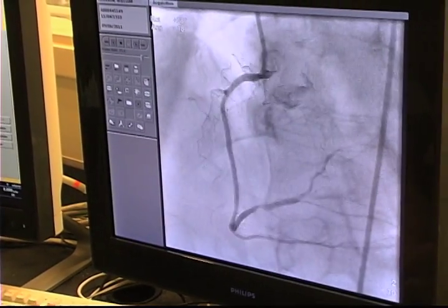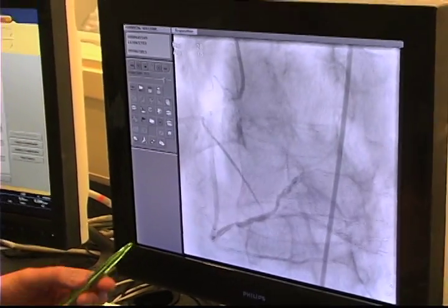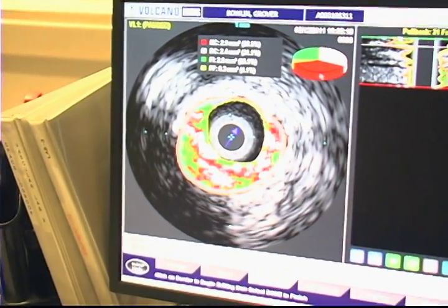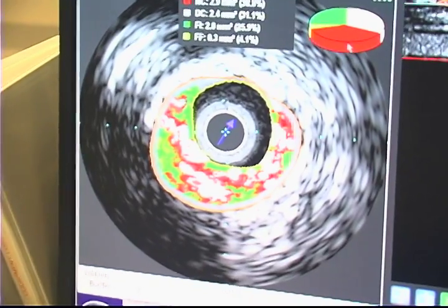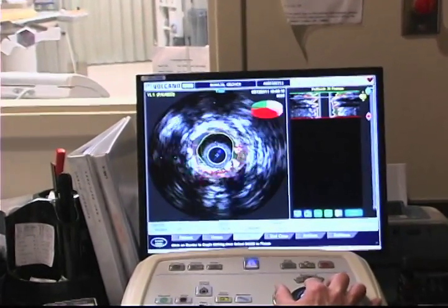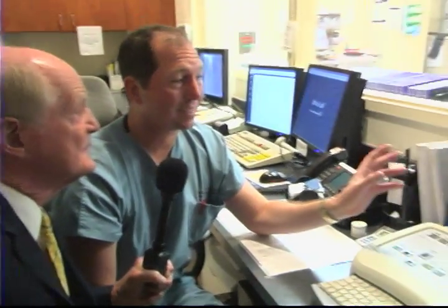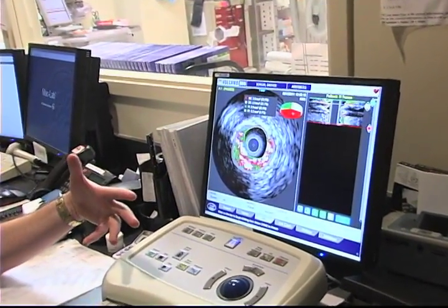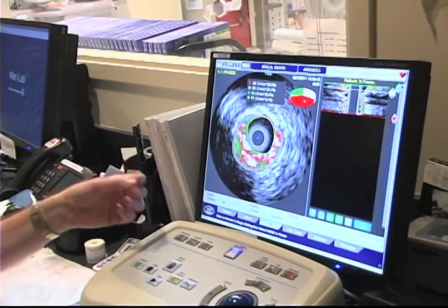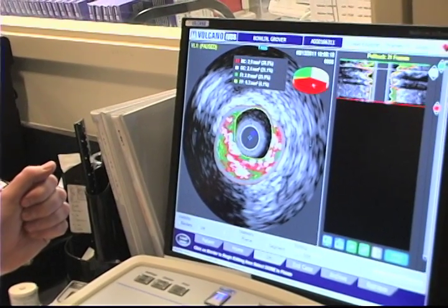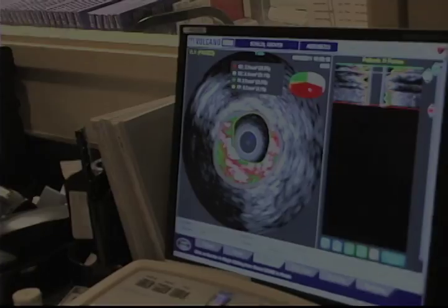This is a coronary blood vessel — you're really looking at an enlarged view here of that same narrowing. That's right. And this is from an image from inside the blood vessel called intravascular ultrasound. We can see very precisely the size of the blood vessel, how much plaque buildup there is in terms of the percentage of blockage, and the type of plaque that's inside the artery. Now we're ready to go with the stent. Is this patient going to do well? This patient should do very well.